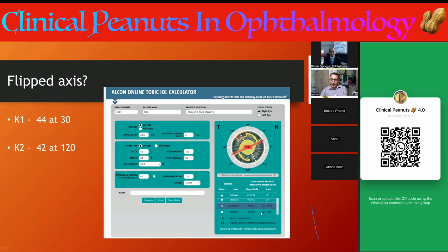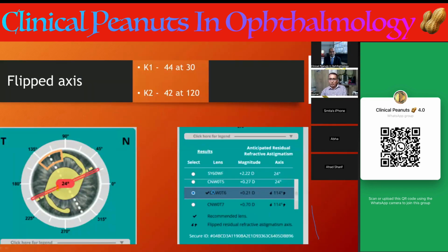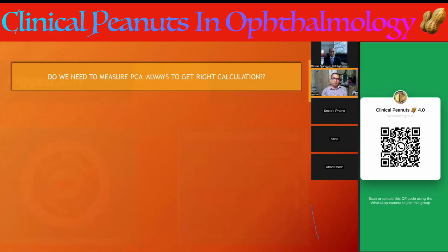Flipping of the axis is not something you cannot choose. It is mainly based on which axis you are leaving the power in and how much power you are leaving over the cornea post-operatively. That consideration is important. Here you can see the residual at 24 degrees, but if you go for this particular model of IOL, the residual will be at 114 degrees, on the flat axis. This is called a flipped axis in the calculation.